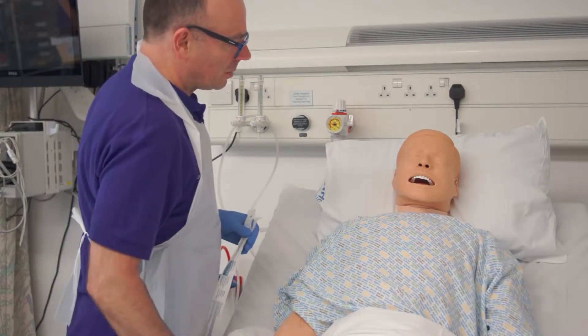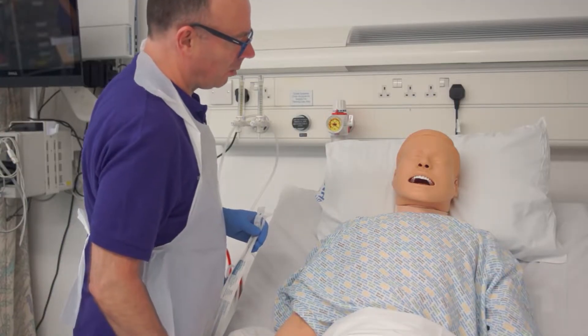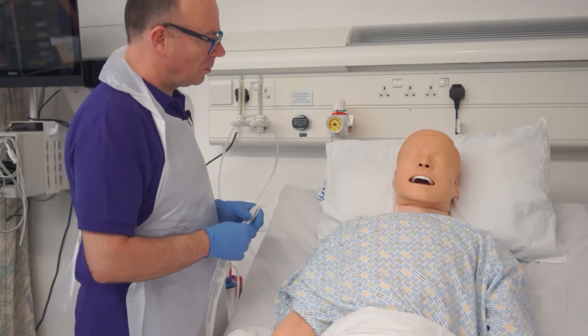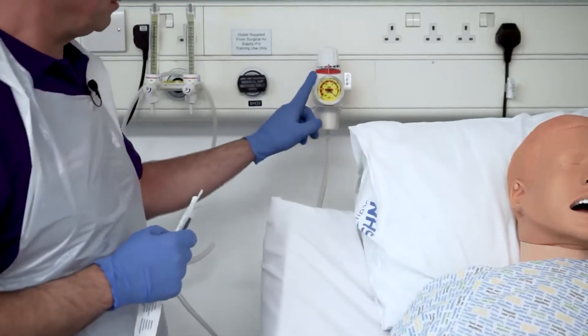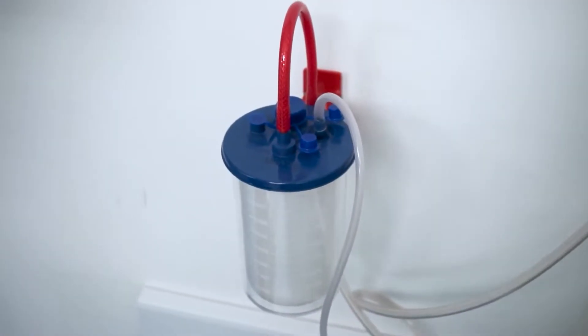Hi Bob, I'm Graham, one of the nurses. I'm going to try and help you clear some of these secretions and help you cough by using some suction in your airway. We've got here a suction control device and a receptacle for any secretions.